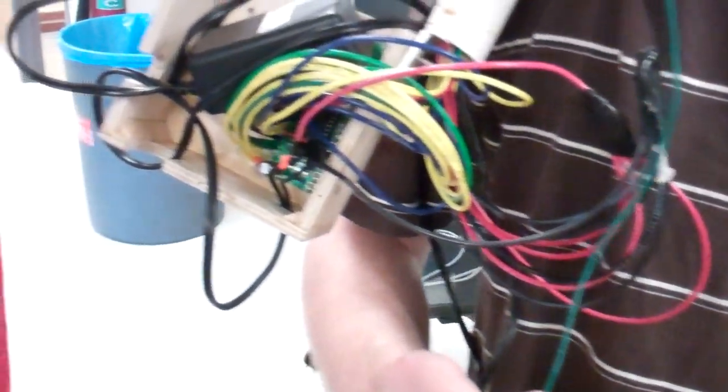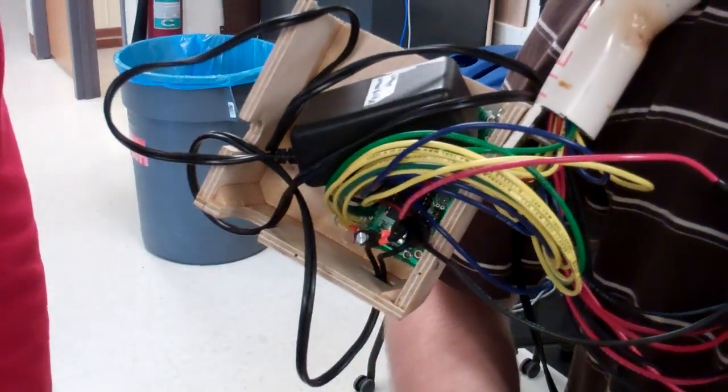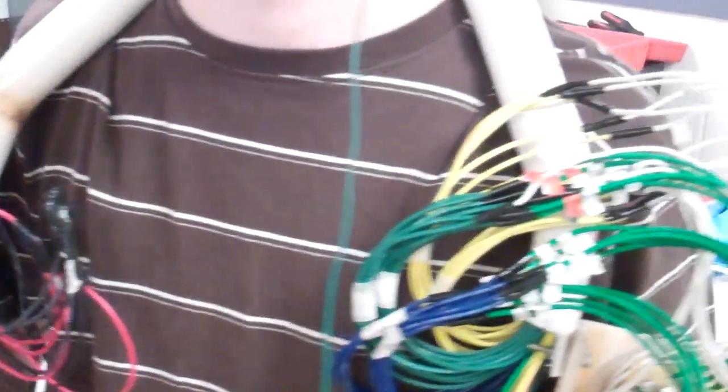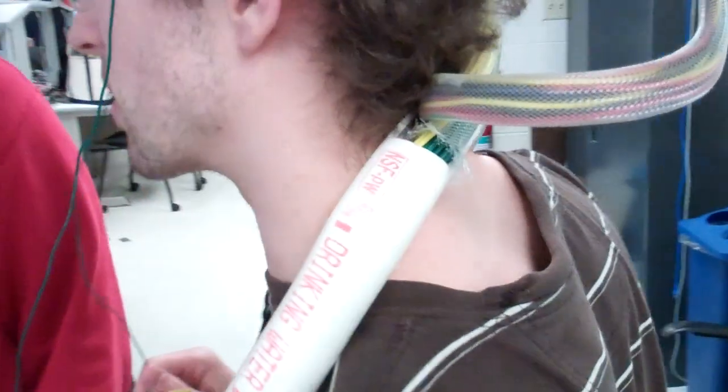And what's on the other side is power, a microcontroller. All the wires are routed through the actual PVC, so there's actually no real exposed wires. Everything is routed through, and then through the back there is the controller.